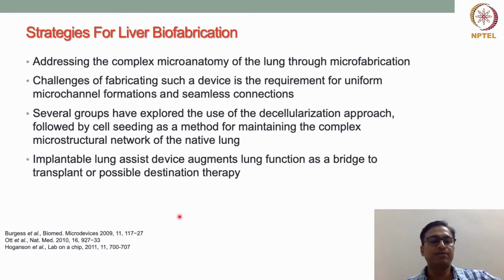This kind of implantable lung assist device has been fabricated to augment lung function, and it can act as a bridge to transplant or possibly as destination therapy. As we discussed earlier, many patients are awaiting lung transplantation, so for them this kind of device can be very helpful. We'll discuss some of these in the next slide.